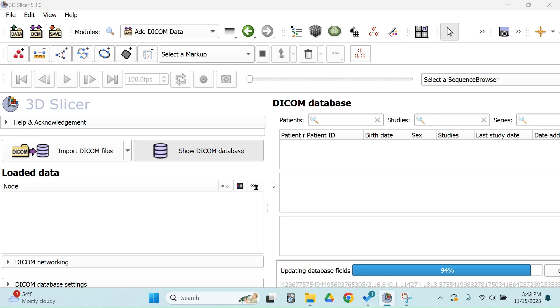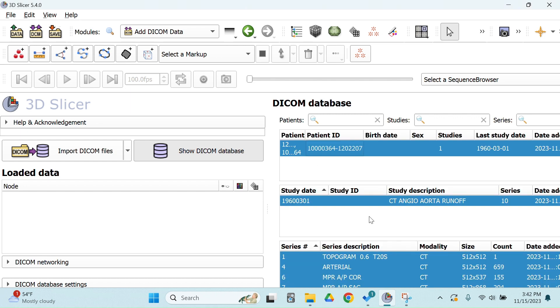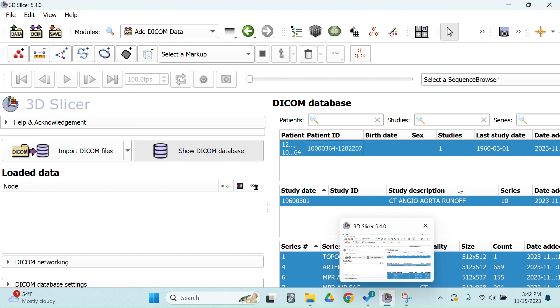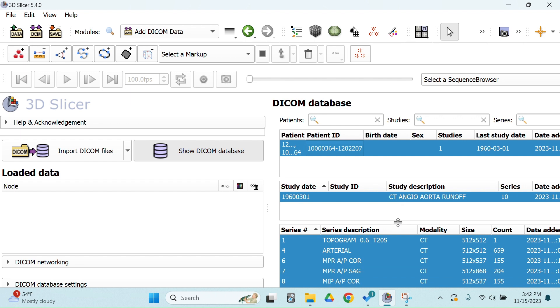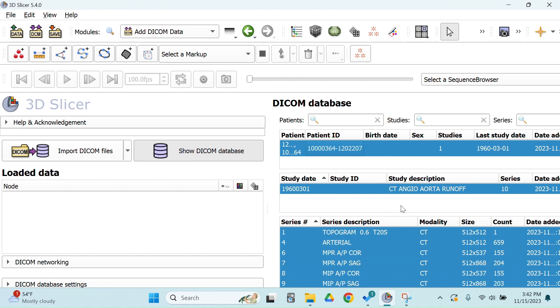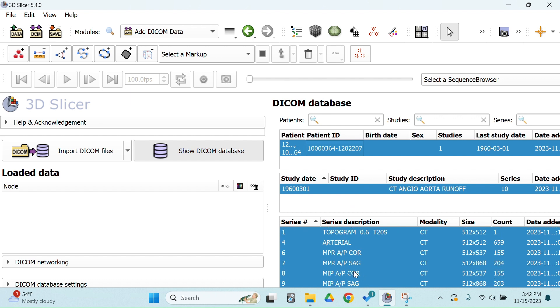This does take a while, so I do recommend closing any applications that you don't need. Great. So we have our DICOM file here, and you can see this is a CT angio aorta runoff, which is a study where contrast is used to look at the lower extremities. This is a great study for us because we need to look at the bilateral lower femurs. You can see there are many different phases in here.